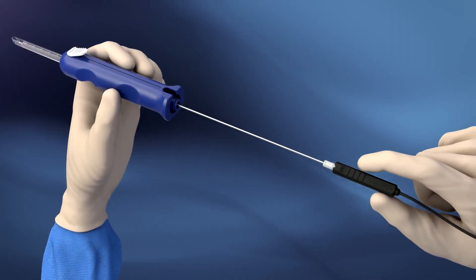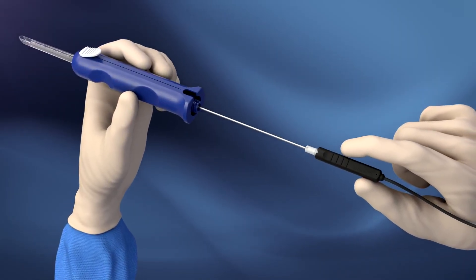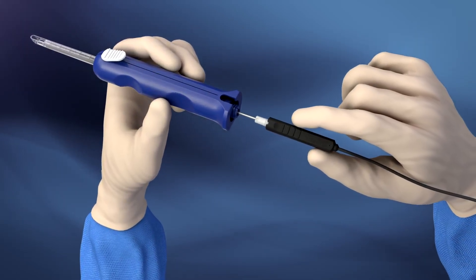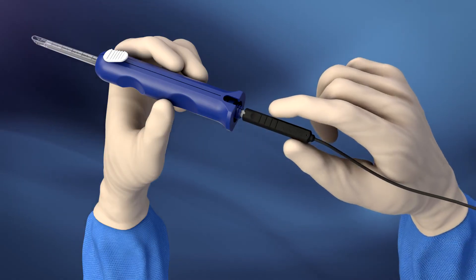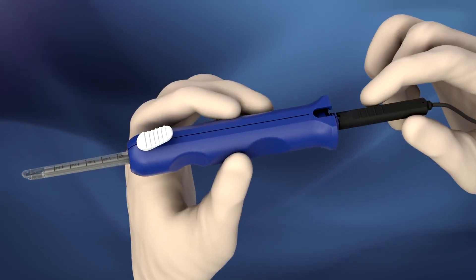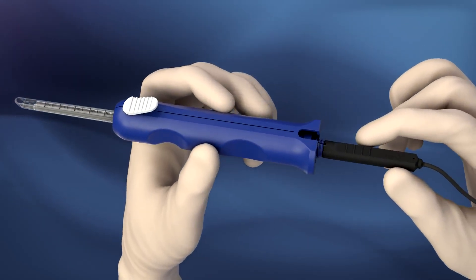Assemble the nanoscopic release system by inserting the nano needle scope into the centerline device. Once the nano needle is in contact with the centerline device, turn the nano needle until it clicks in. This indicates that the scope is fully seated and at the appropriate level for visualization.